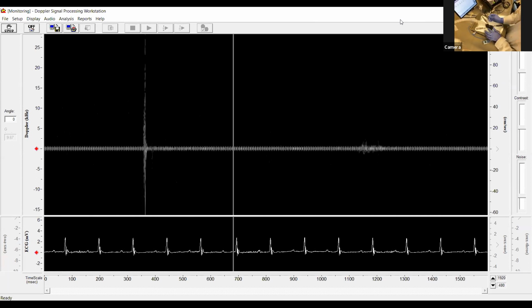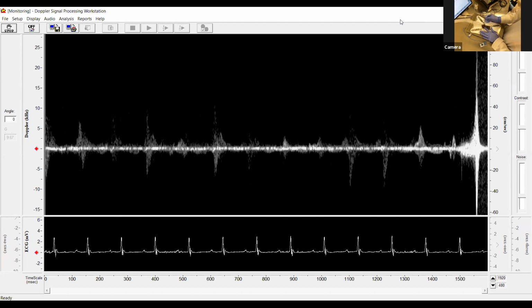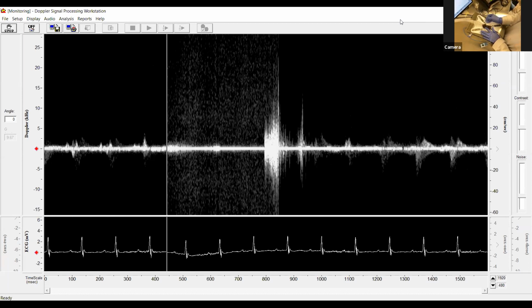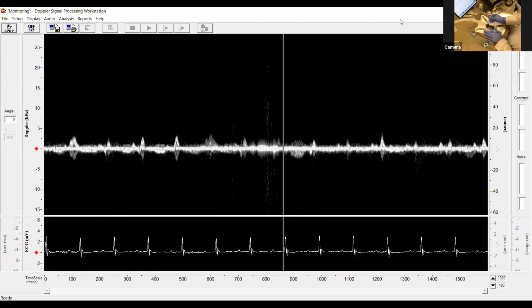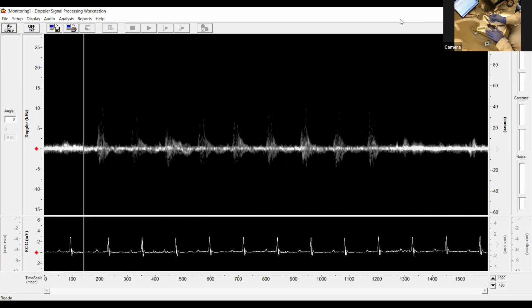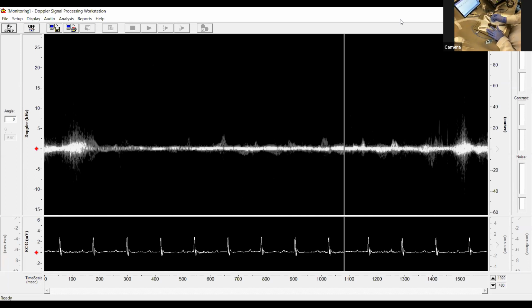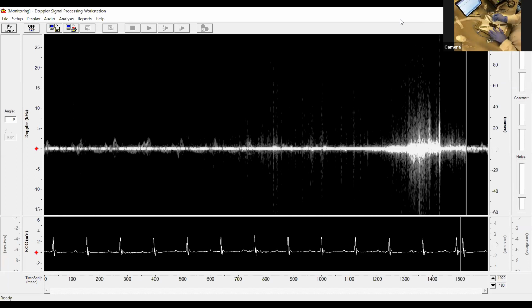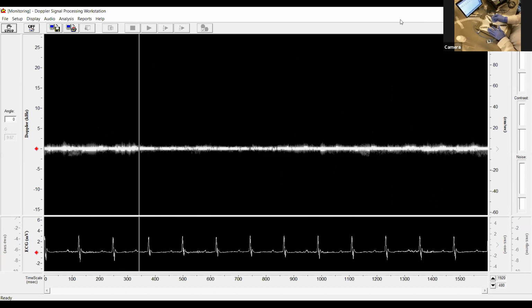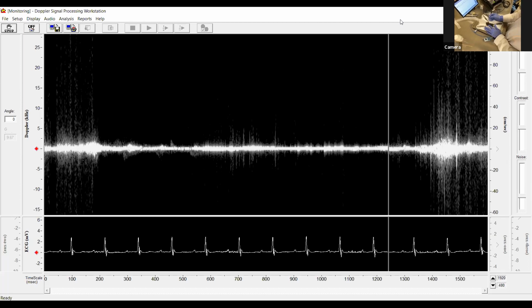But again, it comes down to learning and understanding your strain of animal and any modifications that you have to them to figure out exactly where you're going to see those signals. Nothing's ever simple. So that could mean that finding the coronary might be tricky, although I suspect it's going to be in a similar area to what we're used to.